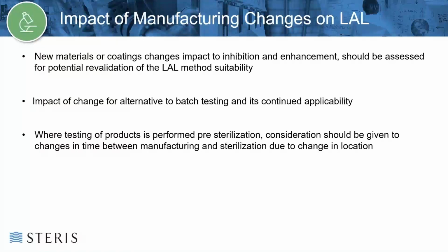9.2.2, reassessment shall be performed for any change that can impact the test, for example, introduction of new materials, processing steps, product configuration changes, method of sterilization for post-sterilization testing, or a different product manufacturing site. This assessment shall include evaluation of the effect of the change on the outcome of determination. The results of this reassessment shall be recorded and suitability studies repeated as necessary.